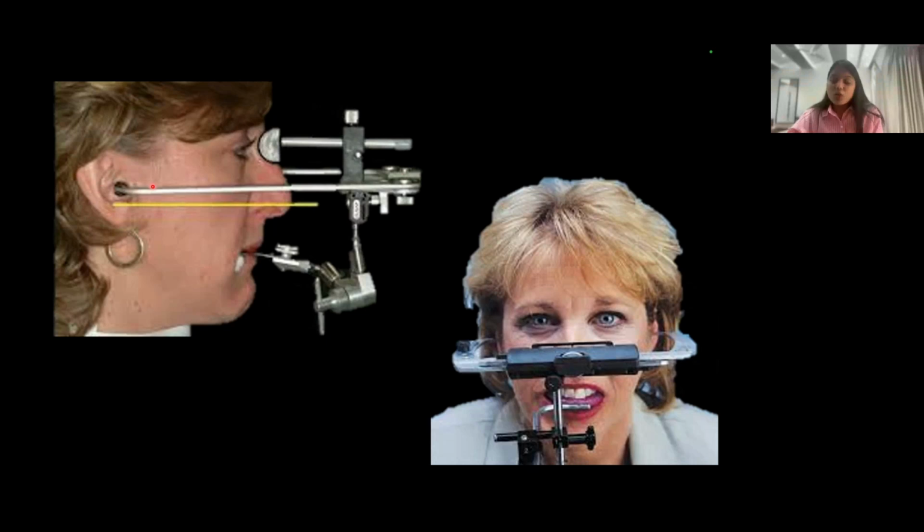Now, arbitrary Facebow is mainly recommended for complete denture patients. The next type is kinematic Facebow. Now, kinematic Facebow gives you the accurate true hinge axis. So that's why it is recommended for full mouth rehabilitations or full mouth implant cases.